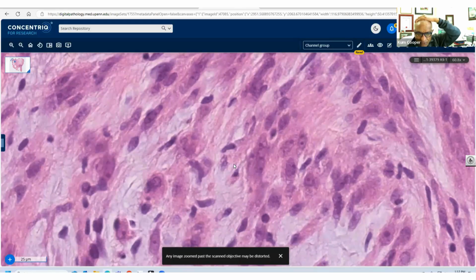You'll recognize SUZ12 from the uterus, right, for endometrial stromal sarcomas. But those are also in that pathway. So Dr. Hu wanted the H3K27me3, which is only lost when there's a mutation in those genes. There's a loss of these chromatin remodeling proteins, in this case, the trimethylation of H3. And so when you do the antibody, it is lost. And that's a positive, quote unquote, positive reaction. So that was intact, Tom.